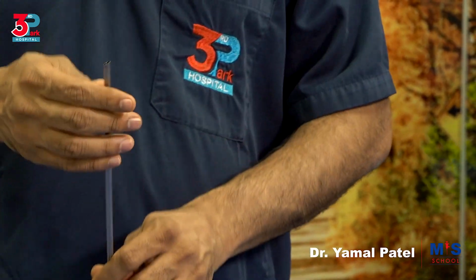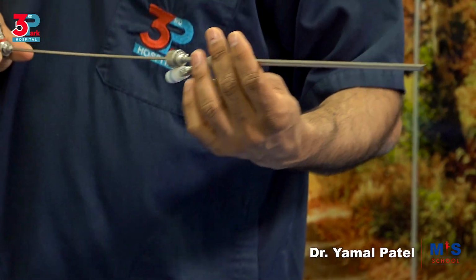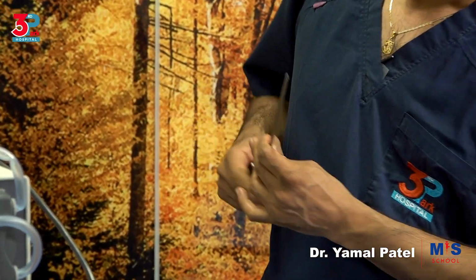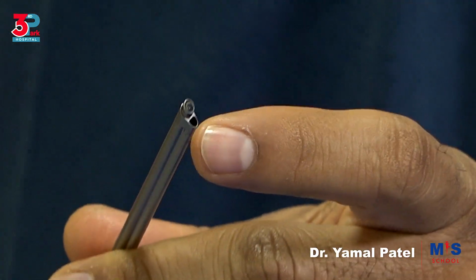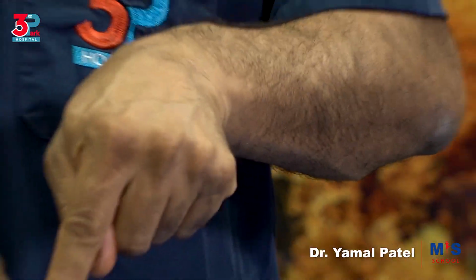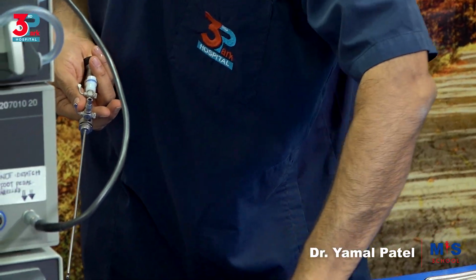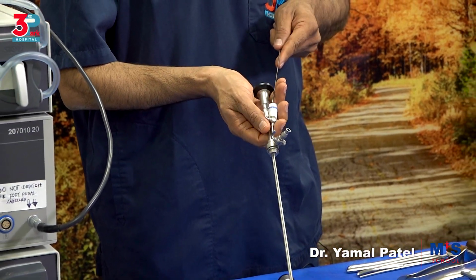So the scope is going to go, if you look closely here, into this round, smaller hole, and then there is another one here where the fluid that is connected will go in from, and so will the instrument that is here. So let's see this.